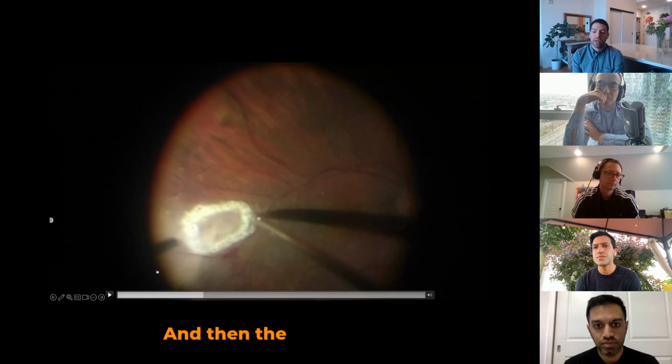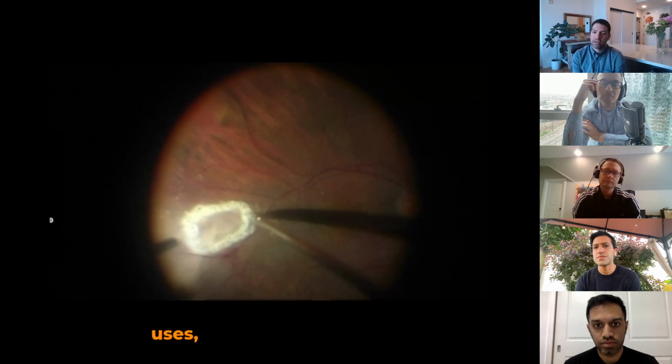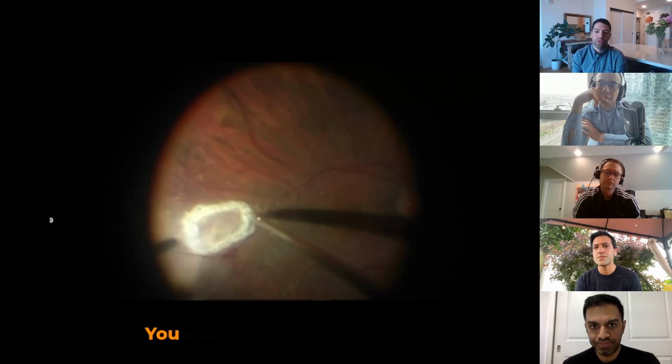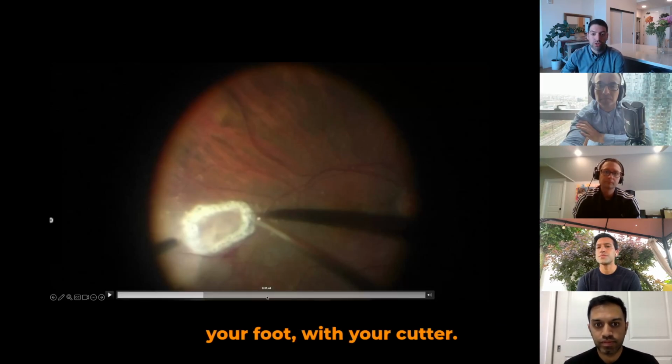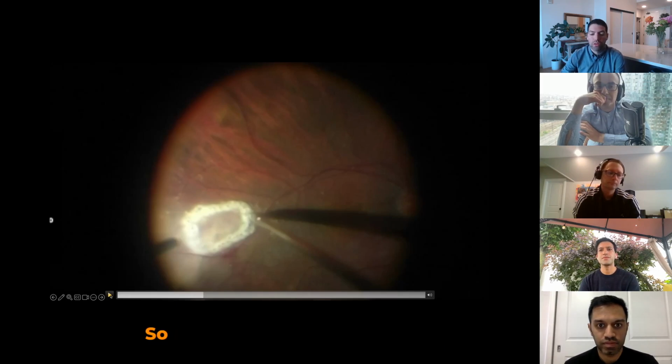And then the third thing that I don't really use because I do 25 gauge, but one of my mentors still does 23 gauge, and he uses, Alcon has a 23 gauge pneumatic vertical scissors, which is pretty cool. You can control the vertical scissor with your foot, with your cutter. So if you use 23 gauge or you have access to that at your institution, that's another technique. So I use one of those 3 instruments.